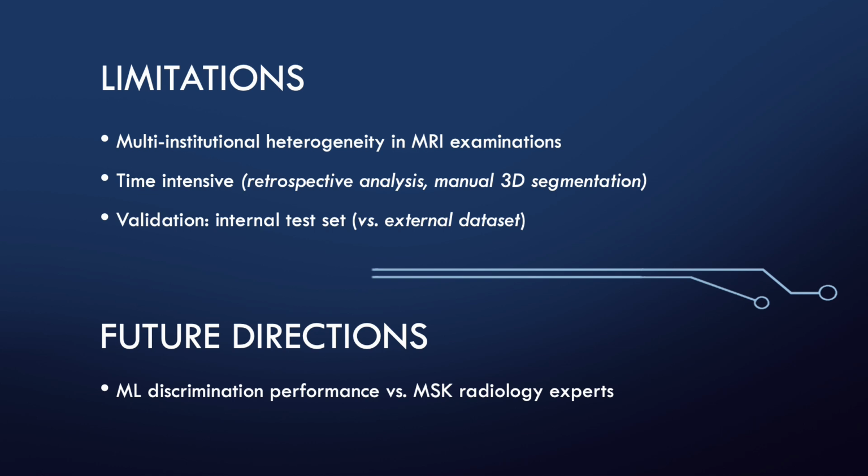While such heterogeneity could be seen as a constraint in the development of optimal radiomic modeling, heterogeneous MRI datasets help to address concerns and limitations of AI models developed using highly uniform homogeneous datasets obtained from a single center, and improve validity when applied to external datasets.